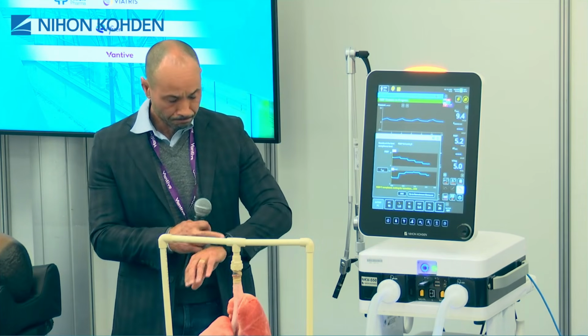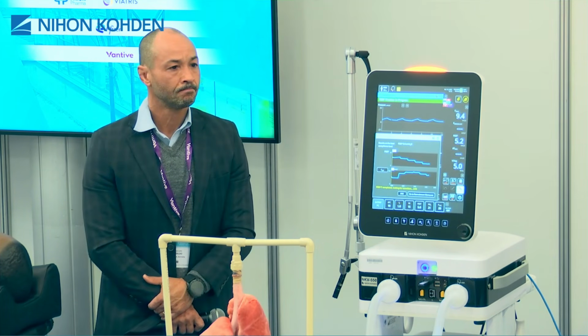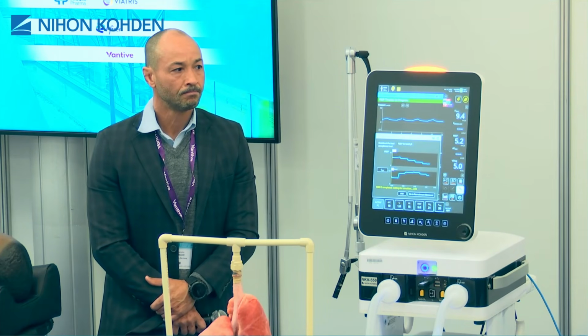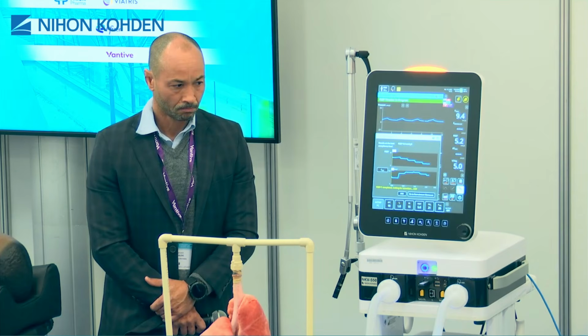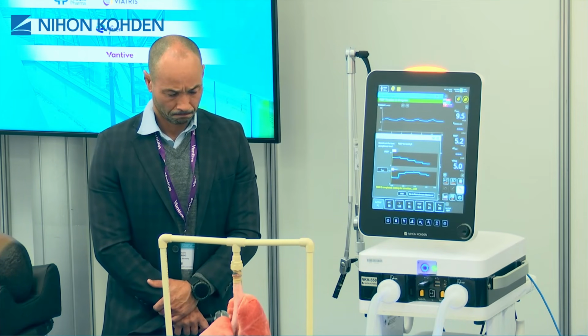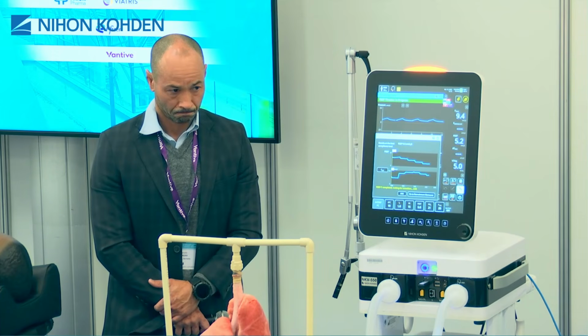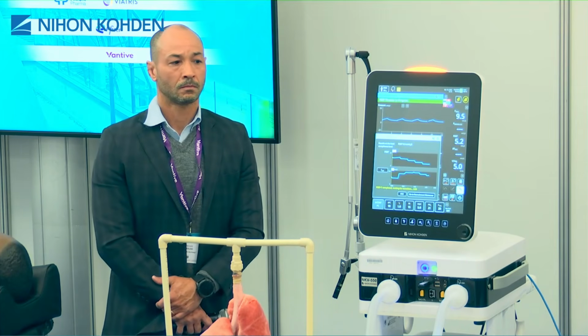This maneuver is just testing how much you are recruiting from 6 to 16 centimeters of water. And recruitment happens in avalanche. Which means that sometimes you have no recruitment up to 16, and then from 16 to 18, you have tons of recruitment.